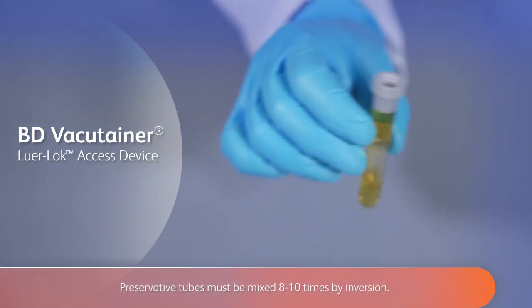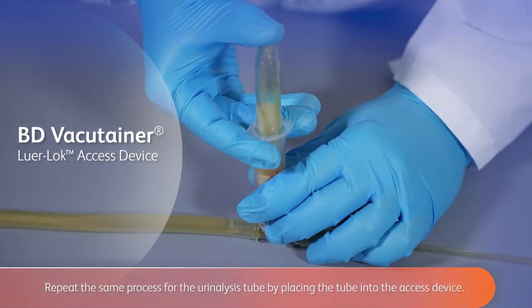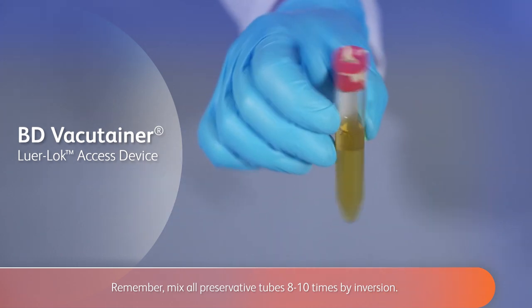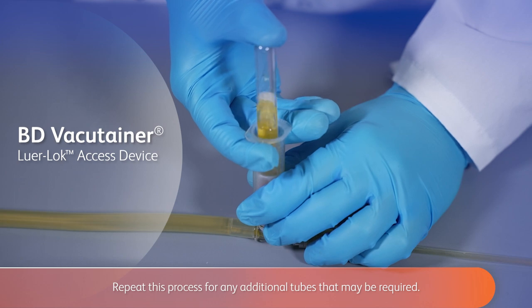Preservative tubes must be mixed eight to ten times by inversion. Repeat the same process for the urinalysis tube by placing the tube into the access device. Mix all preservative tubes eight to ten times by inversion. Repeat this process for any additional tubes that may be required.